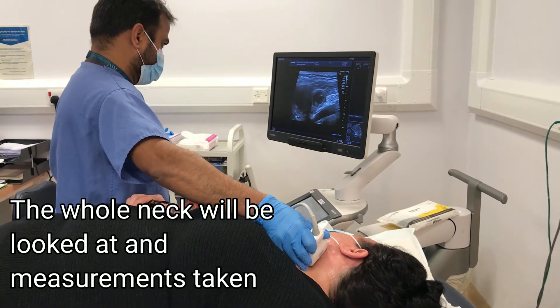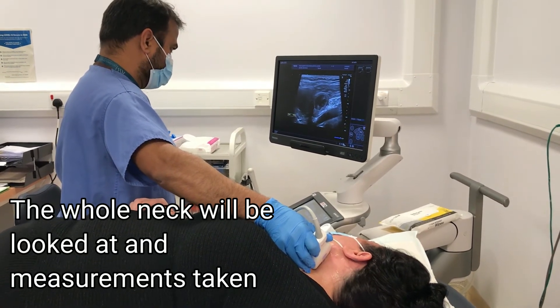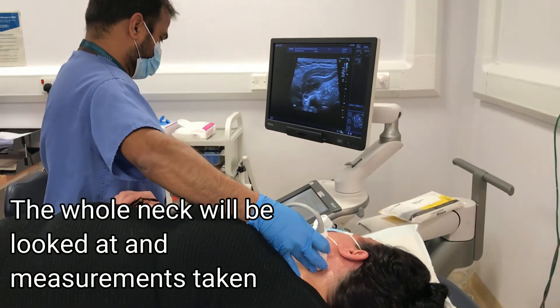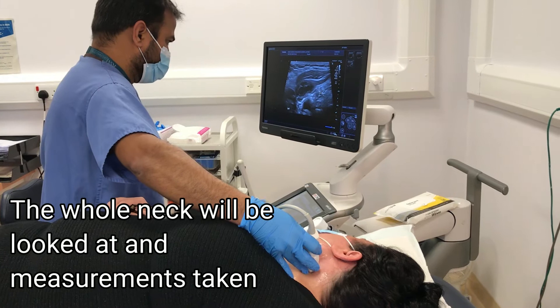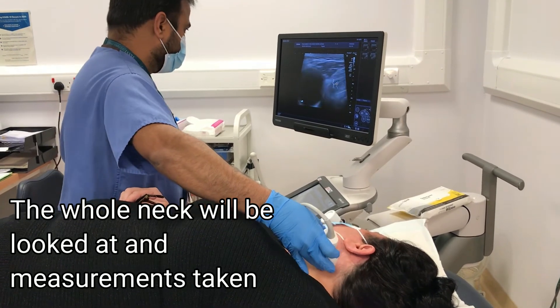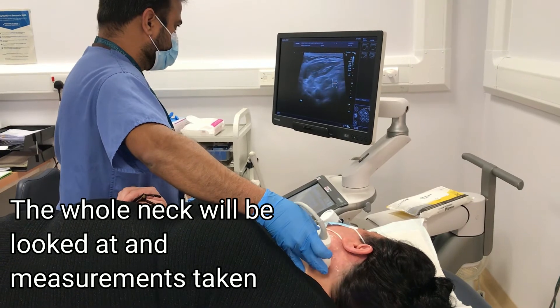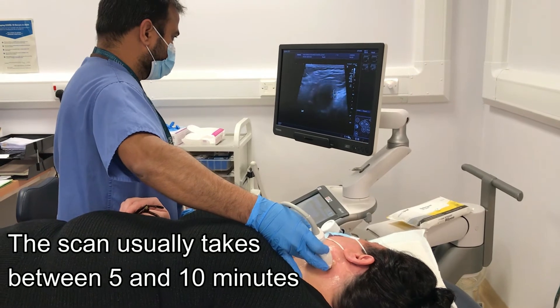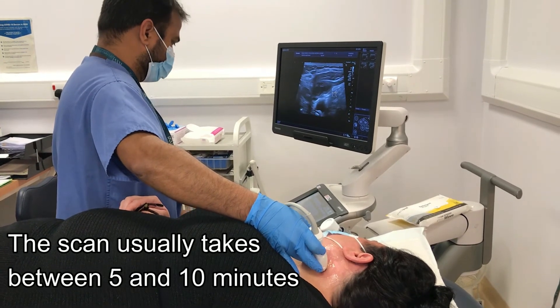Usually both sides of the neck are looked at and measurements are taken if any swellings are seen. Having an ultrasound scan on its own with no biopsy normally takes between 5 to 10 minutes.